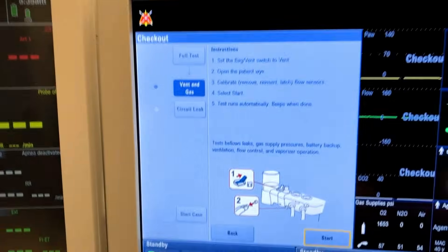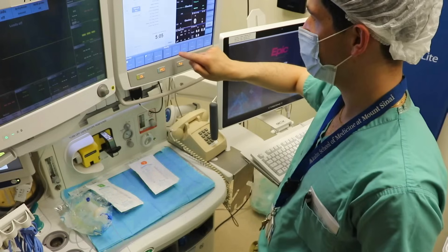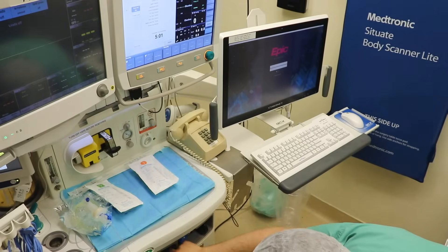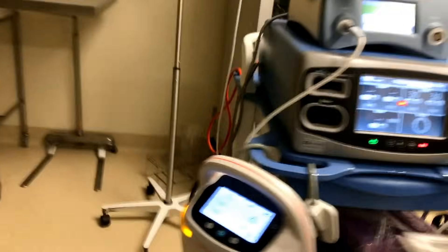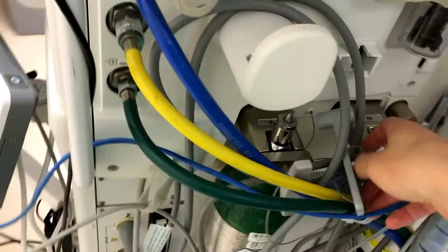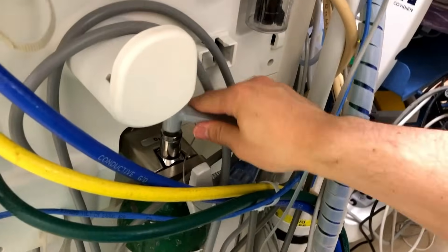That test is going to run alongside the rest of my machine check, which includes looking at gases to make sure that my volatile cartridges are full. I also need to get to the back of the machine and turn my O2 tank off, because if I don't, there's a possibility it may leak throughout the course of the day and become empty when I actually need it.